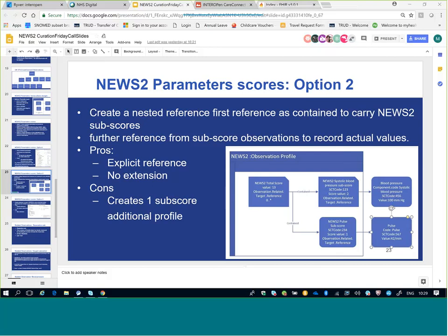We've been implementing, we were able to get a NEWS score and all components resources back in one go simply by using the include parameter on our API call. So I think there's a way of getting all that information back in one go without resorting to having contained resources.